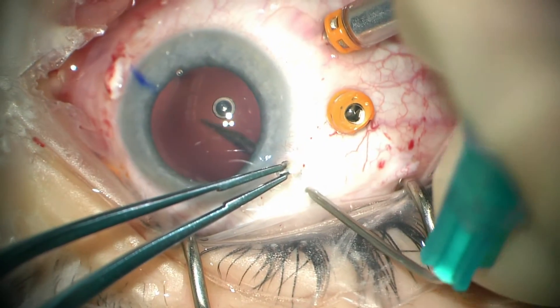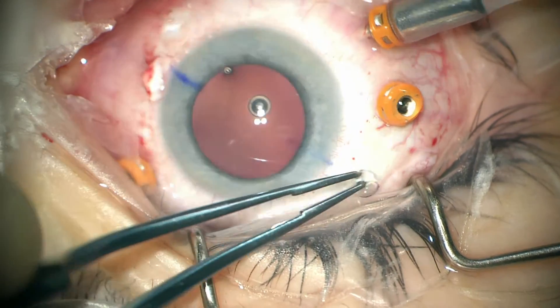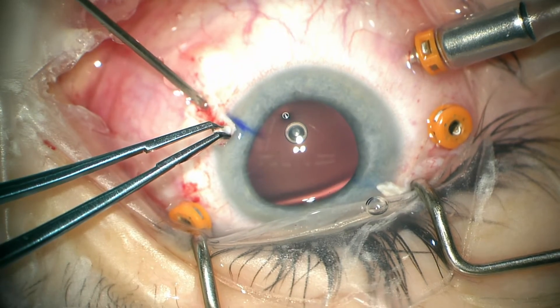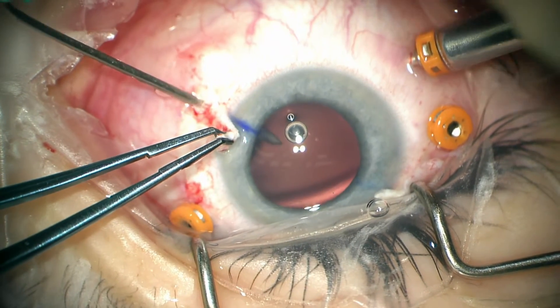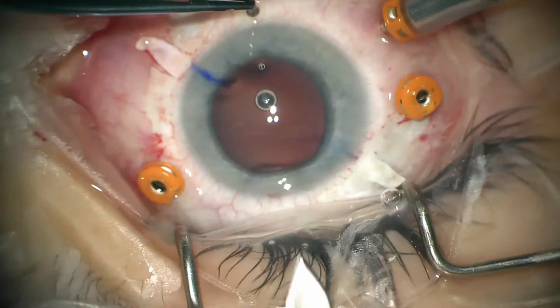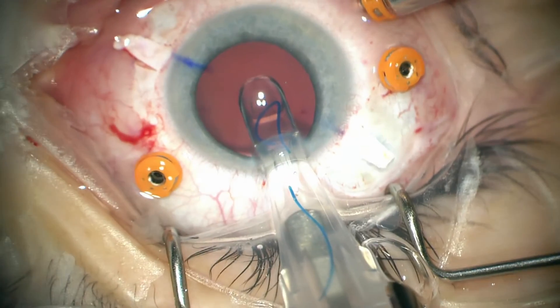So we've measured about 2.5 mm back, and we'll use a 23 gauge needle to enter the eye underneath each of the scleral flaps in line with our previous marks. Next, the EC3 lens is going to be inserted through this 2.75 mm clear corneal incision superiorly.